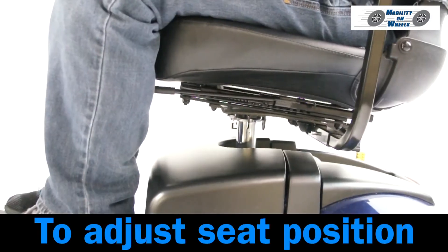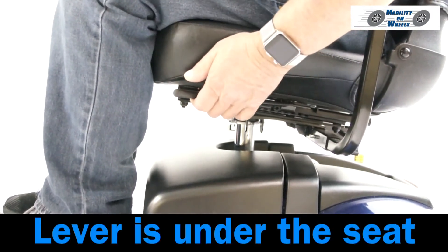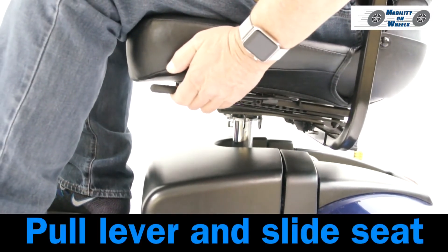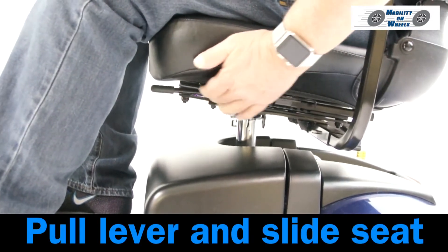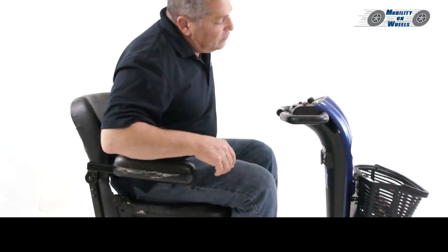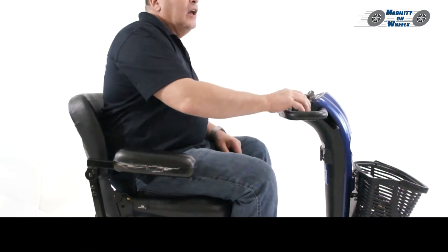To adjust the seat position, locate the lever under the seat. Pull the lever and slide the seat to the desired position. Put both armrests down. Put the key in the ignition and turn on, and you're ready to go.